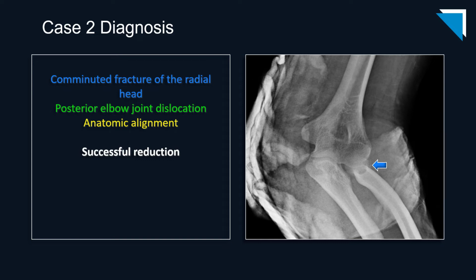For example, there was a case a while ago of a cervical spine study done post-trauma where there was significant motion artifact. And you could see, despite the motion artifact, that there was evidence of hardware failure. So when we just shut off and say the study is limited or non-diagnostic or suboptimal, we sometimes miss important findings. So make sure you take a look at everything, even if the study is limited.